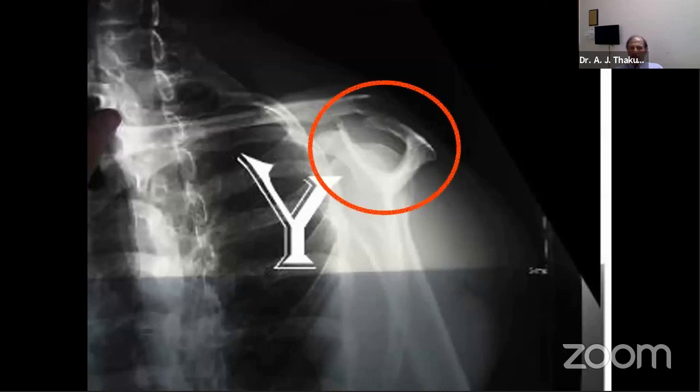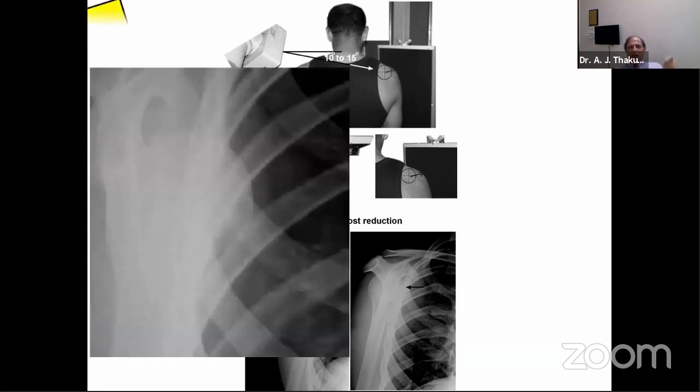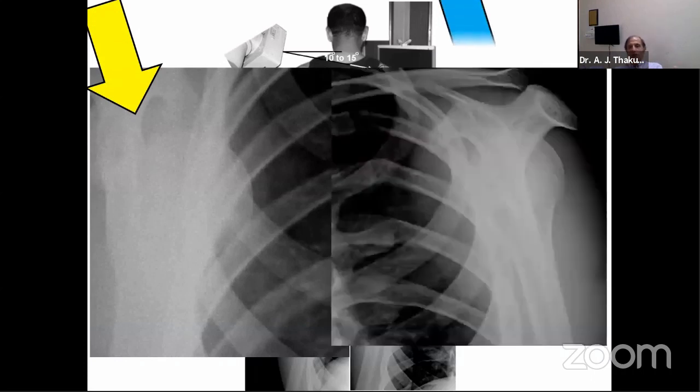So, Y lateral. In this picture, it is perfectly looking like a Y. This is the way to take it, 10 degrees and the marker of the scapular spine, and you can do that. This is a Y lateral which is showing a dislocated shoulder, and this is the picture which was taken after reduction, and now you can see it is in position. This is the Y, and the head is anteriorly lying like this, while after reduction, this is the Y, and the head is right in the center of that Y.